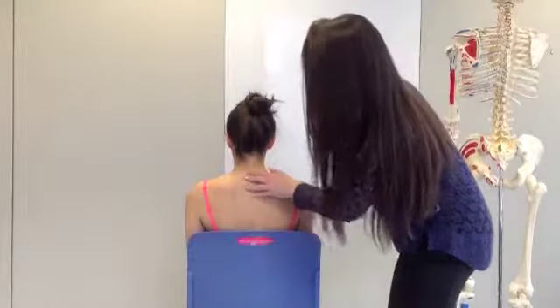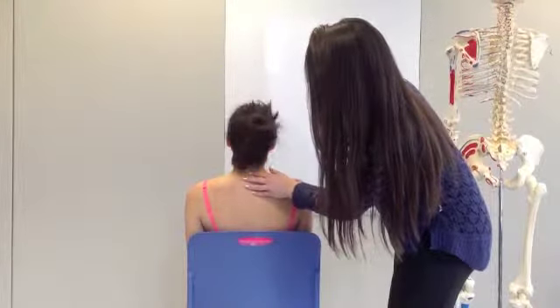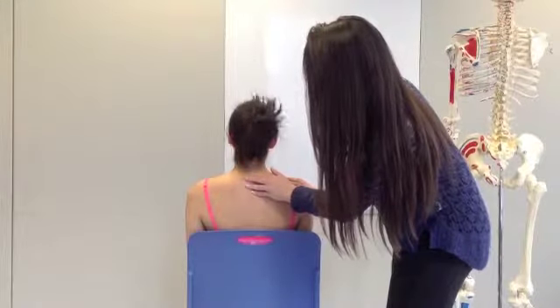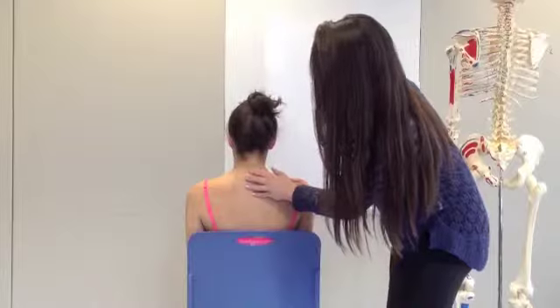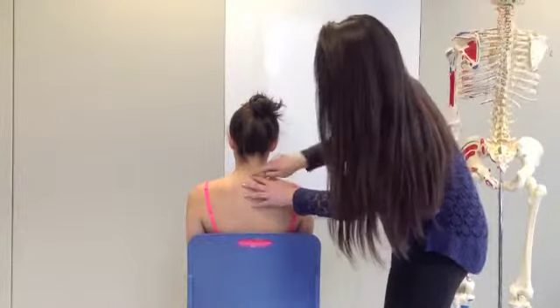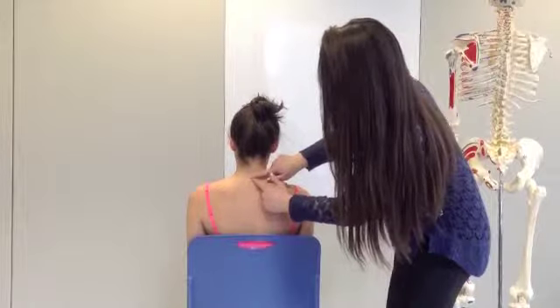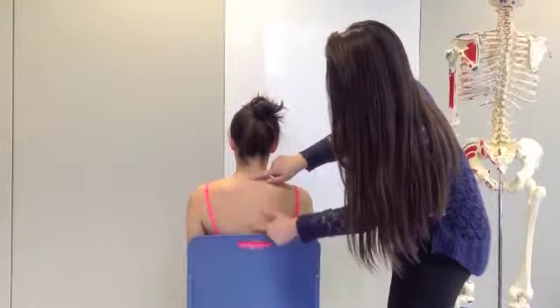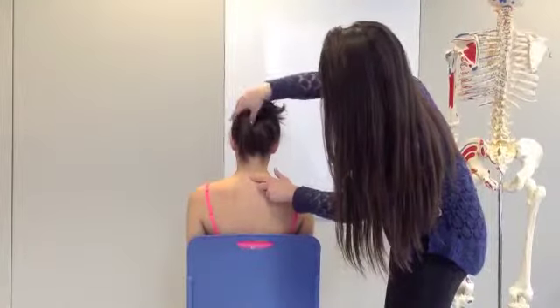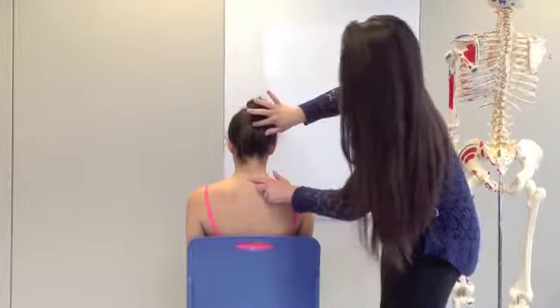So I'm going to have you look back at the ceiling again for me. Good, move forward. And again. Good, and back forward. So Kelsey's C7 is right here. So that's where our fulcrum would be. Then we would line up the stationary arm with the rest of her spine, the spinous processes, and the movable arm with her occipital protuberance, which is right here.